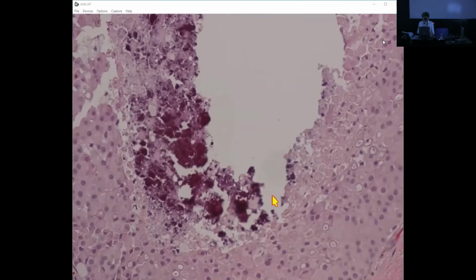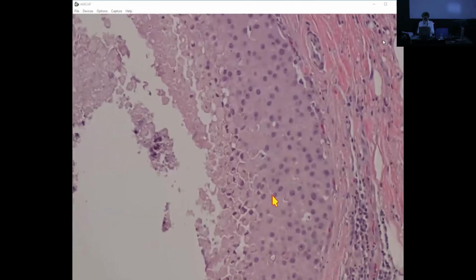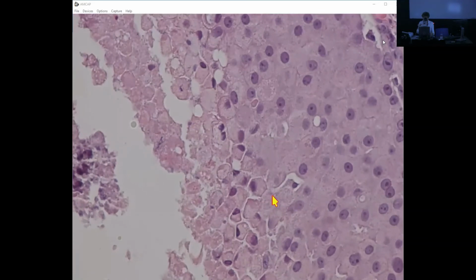Yes, sometimes that is a helpful feature in establishing whether it is ductal or lobular. Not always, but in general, they reveal themselves definitively, even without the use of immunohistochemistry. You see they are all nice and round, plasmacytoid, ovoid in shape. I'll show you another case.